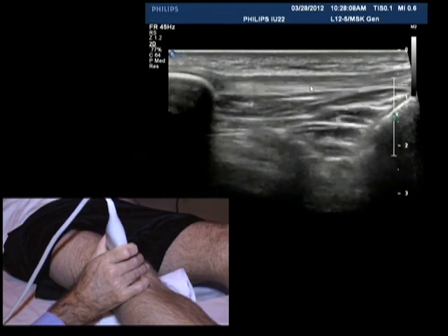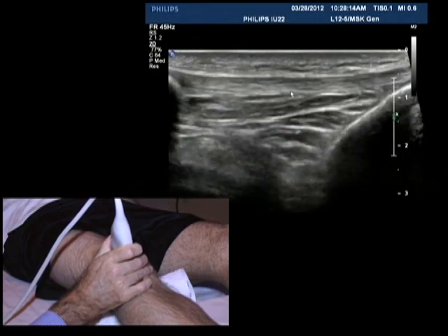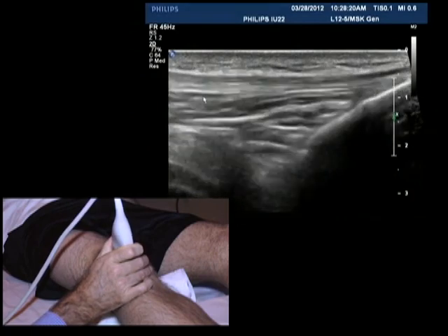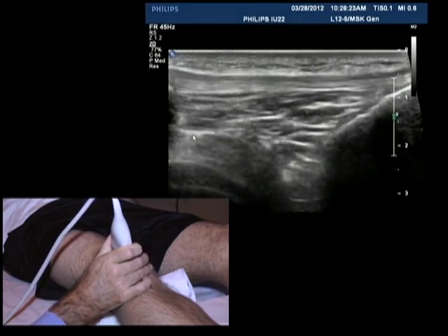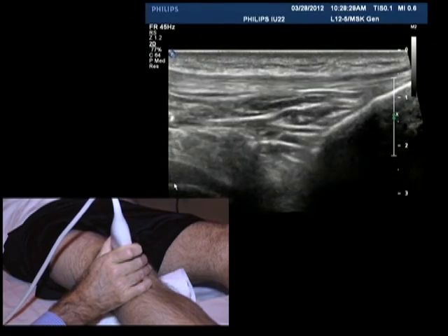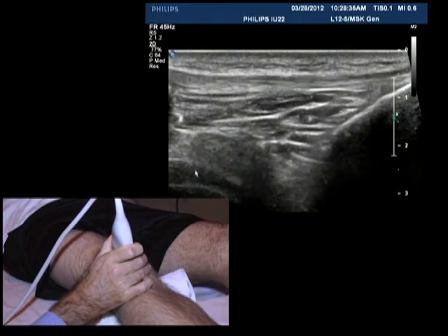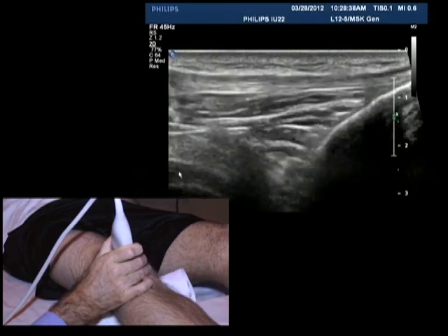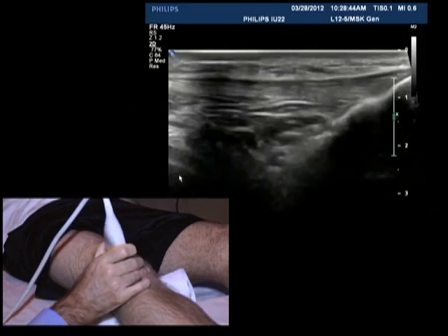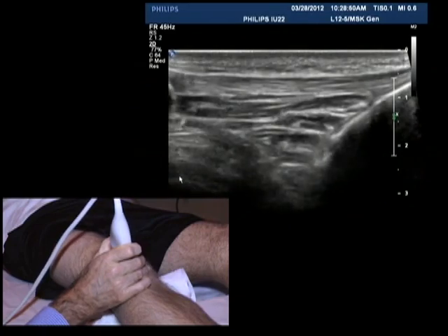It's going to run from the inferior pole of the patella downwards to insert on the tibial tuberosity. And then immediately deep to that is Hoffa's fat pad, that extensive prominent fat pad over the anterior knee joint. And then we can just see sneaking in here some of the subchondral bone plate of the femoral condyle with the adjacent, see this hypoechoic area, that's actually hyaline cartilage. All right, so that's the longitudinal patellar tendon. And it jumps out, right? It's not particularly difficult to find.